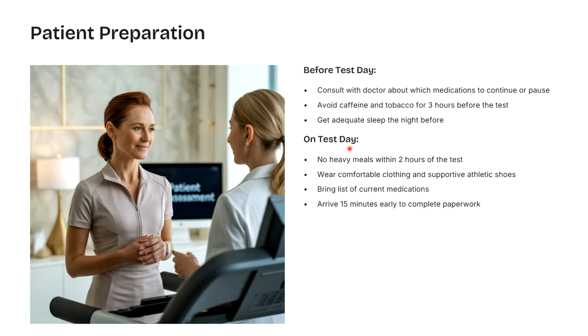Now on the test day, no heavy meals within 2 hours of the test, because it may cause stomach discomfort. It may produce some bloating, or there may be formation of gas which may hinder the performance, or there may be some discomfort in the chest.